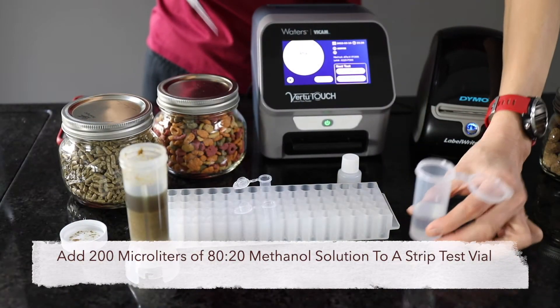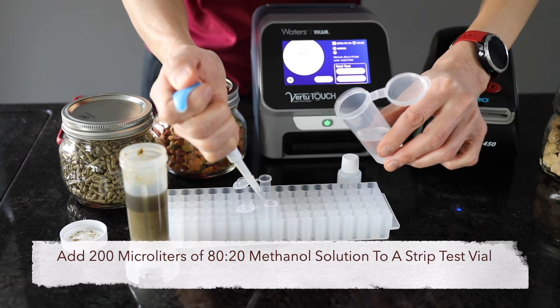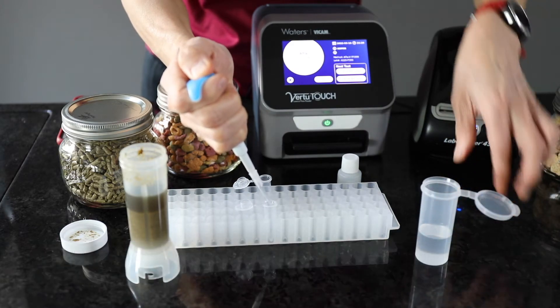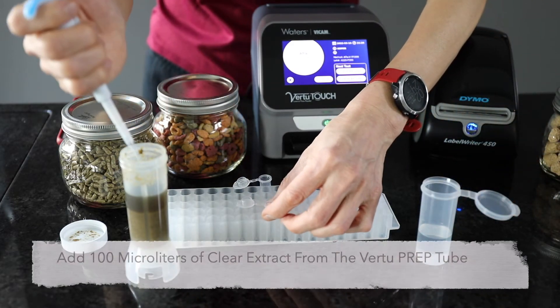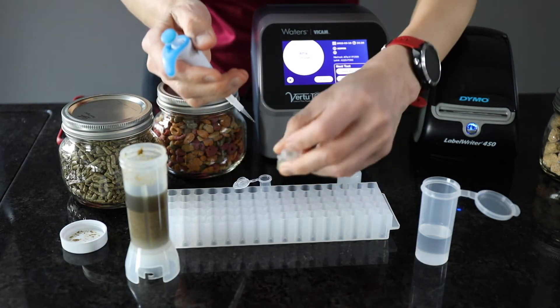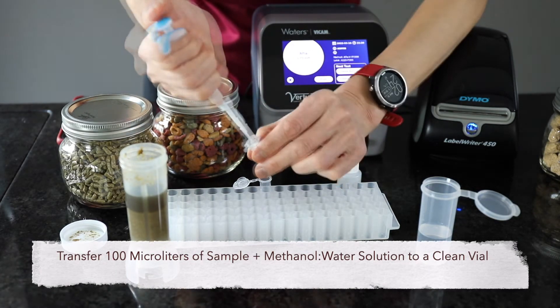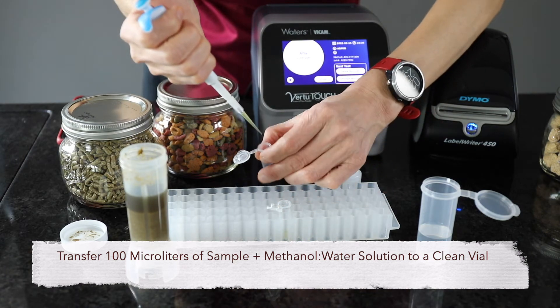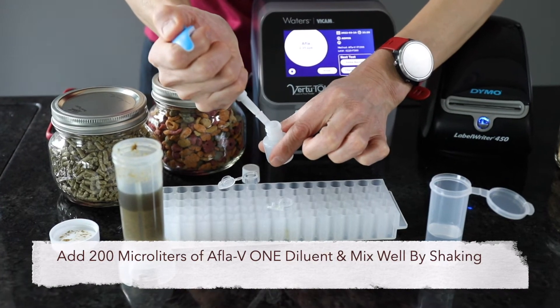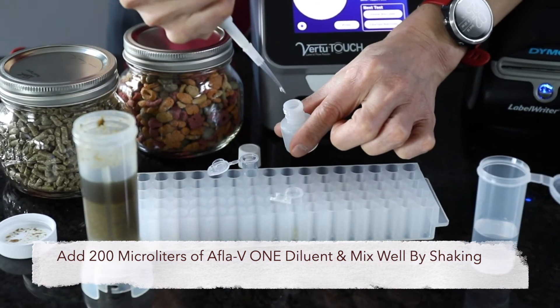Add 200 microliters of 80/20 methanol to a strip test vial. Add 100 microliters of the clear extract to the same vial. Then add 200 microliters of Afla V1 diluent into the new vial containing the diluted sample.